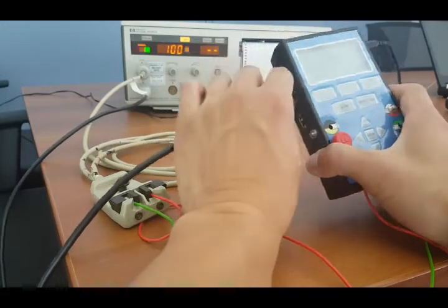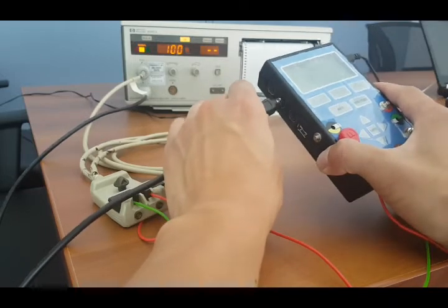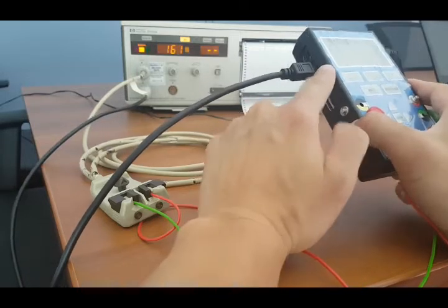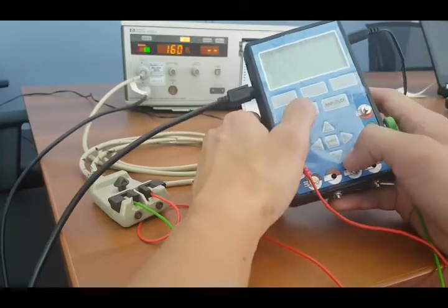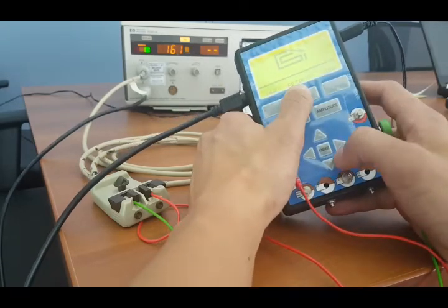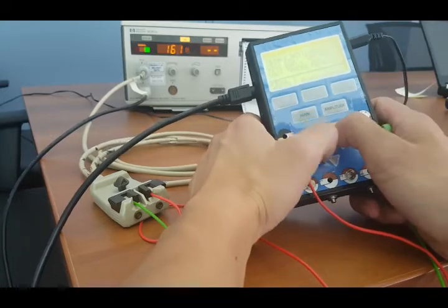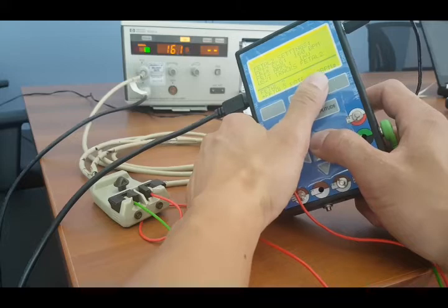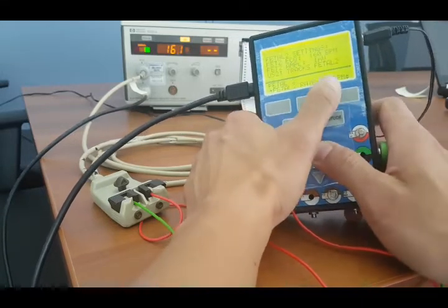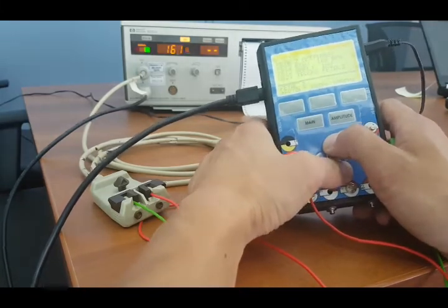Okay, so to change to ultrasound port number 2, I can simultaneously, at the same time, connect my output to US2. To access options for US2, I simply go back to my main menu and go into fetal 2. So fetal 2 relates to US2. I have a different set of waveforms available here. You can see right away the monitor is already reading 160 beats per minute, and that is exactly the value. I can actually toggle through all the options available to me.